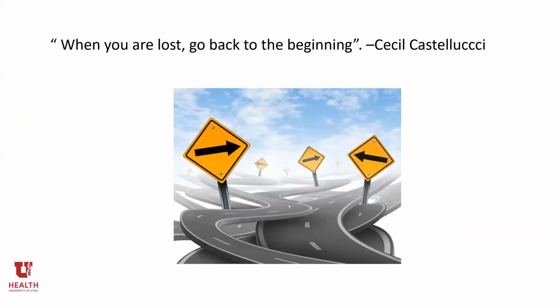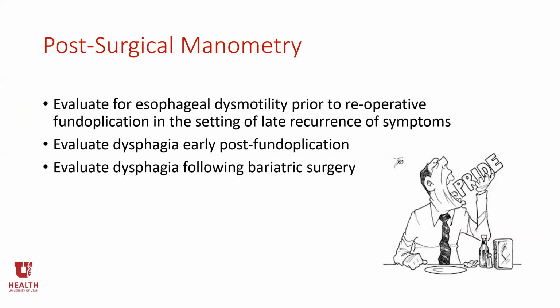When you're lost, particularly in foregut and bariatric surgery, sometimes it's important to go back to the beginning. And dysmotility of the esophagus, dysphagia after bariatric and foregut surgery is a great example of this. Manometry is useful in these patients to evaluate for esophageal dysmotility prior to reoperative fundoplication in the setting of late recurrence of symptoms, and also for early postoperative dysphagia after fundoplication.